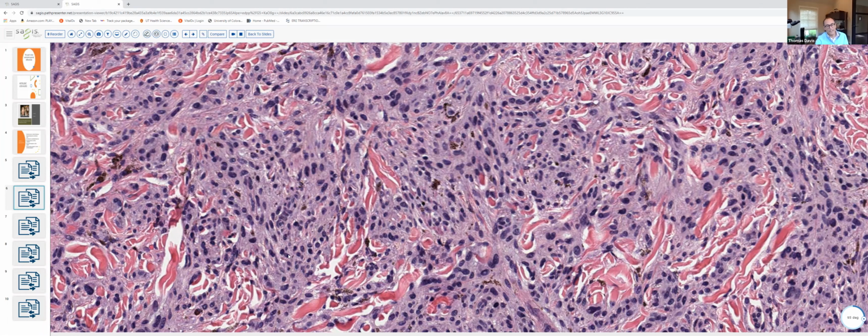Most of the melanocytes tend to have oval nuclei. Some are a little more spindled, some can be fusiform, and some of the cells can have round nuclei and abundant cytoplasm. That is, they can have a little bit of an epithelioid appearance. Most cells comprising blue nevi are lightly dusted with melanin pigment. So if you were to look under higher power, you could see very faint melanin pigment within their cytoplasm. And then between the cells in the dermis, one can see some melanophages.